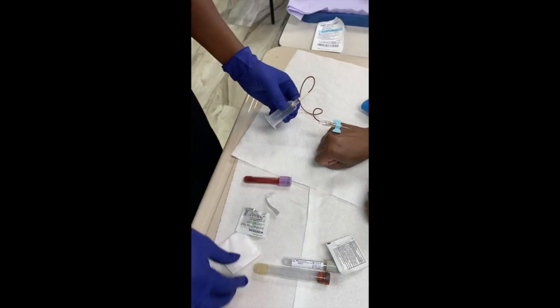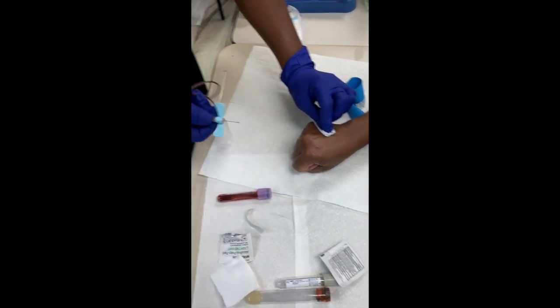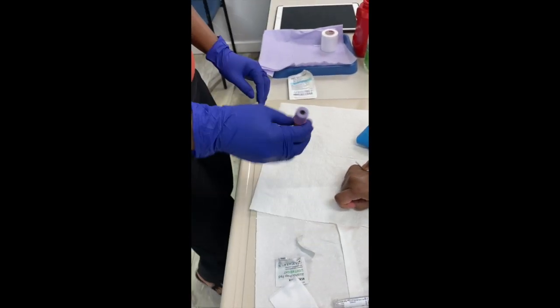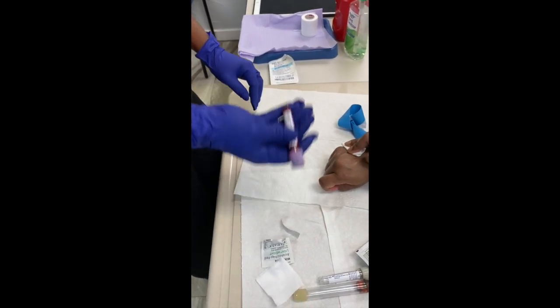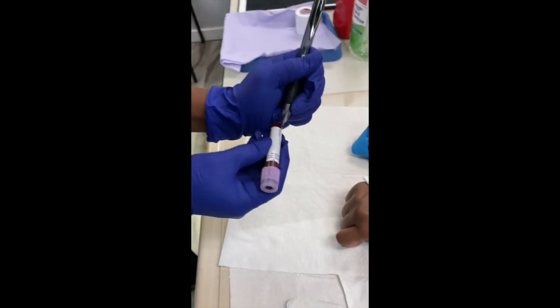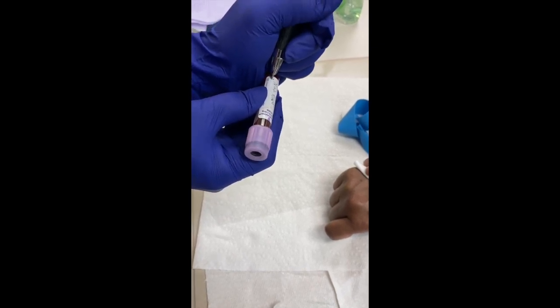We can sit that down and you can see how it stays nice and flat. We're going to come out fast, and immediately — safety comes first. Ask your patient to hold on to that. While she's holding on, we're going to invert the tube eight to ten times because it does have EDTA in there — that's a special type of anticoagulant that requires that. Before your patient leaves, you want to always label: first name, last name, date of birth, the date, time, and your initials.